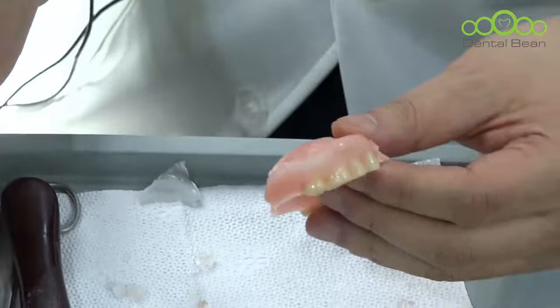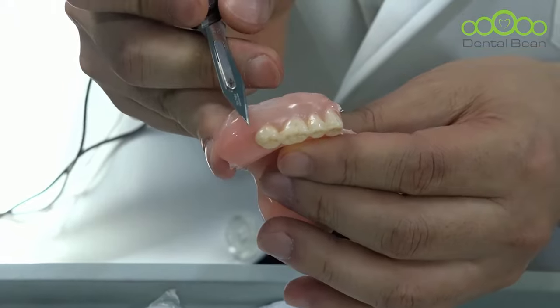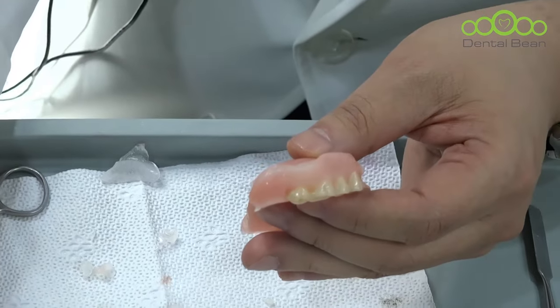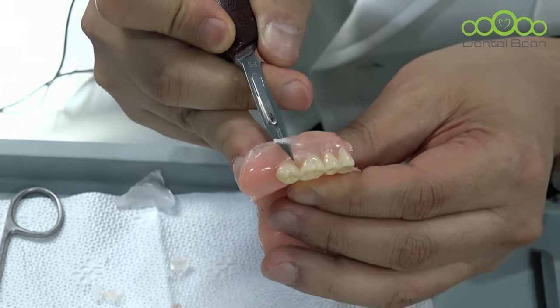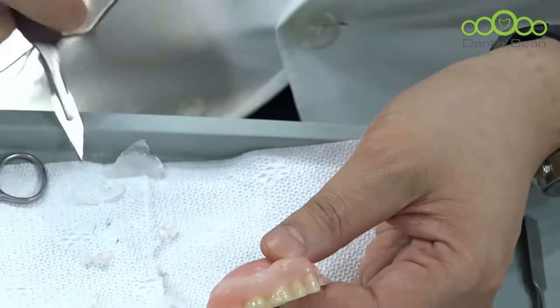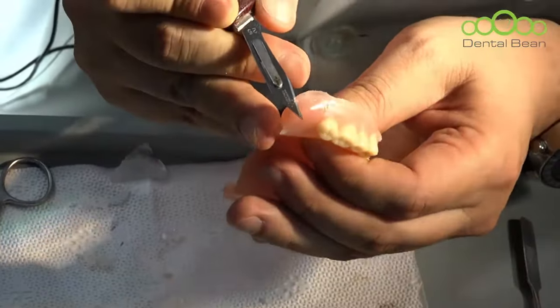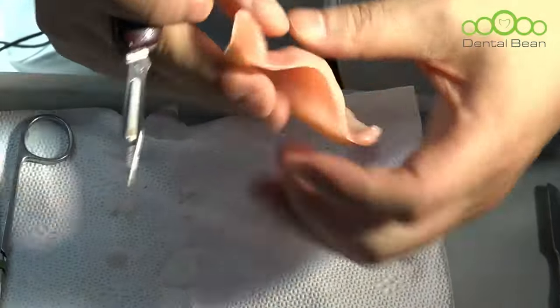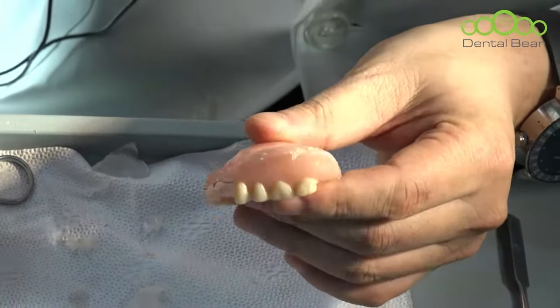And then please position the blade in the bevel direction. Like this. It's good to position the blade in a bevel direction to remove this excessive soft liner from the base, from the porous surface.